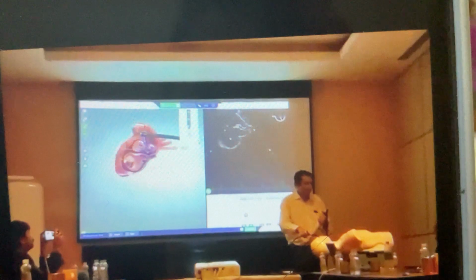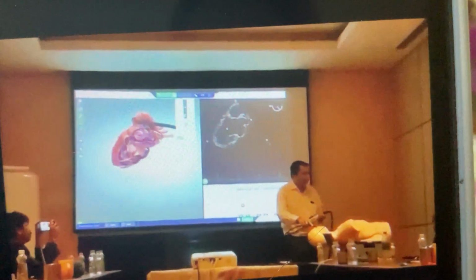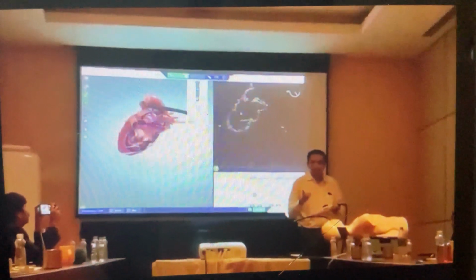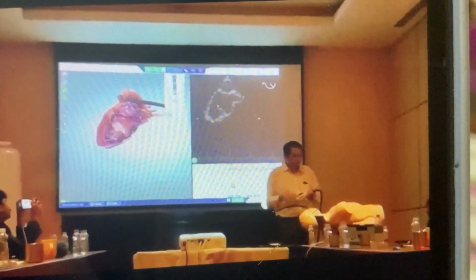Here I can see SVC, right superior pulmonary vein and the whole of the SVC. Okay. Further down, I go 125, 130 and I push the probe more inside, slightly to the left, and I get this view. What are the things which I see? SVC, RA appendage, RV free wall, and I see the opening of the coronary sinus. Okay. So IVC has been replaced by the coronary sinus.